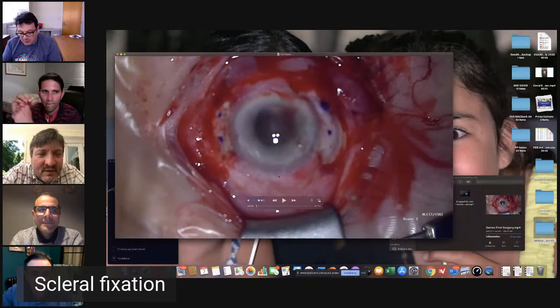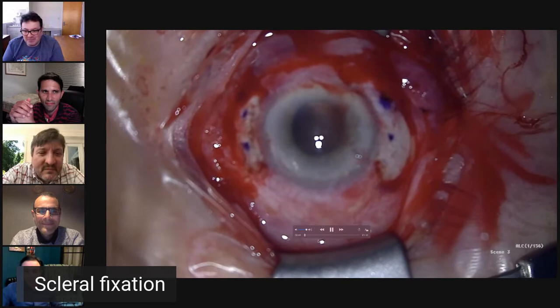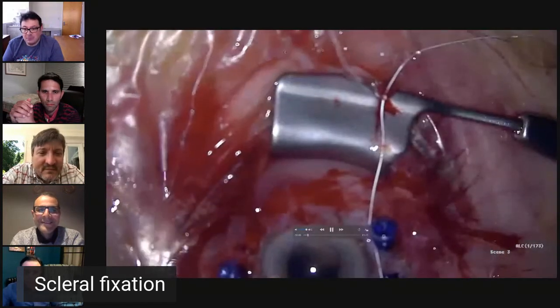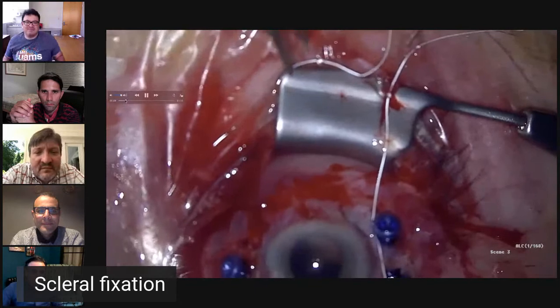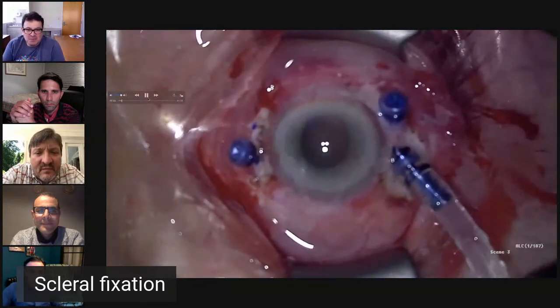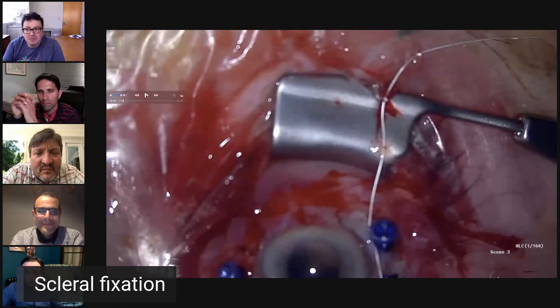So this is my first case. You can see from the start, it's already looking not that great. Yeah, very bloody. So basically I've done the conjunctival incisions. Let me just, one second, where am I? Let me get this out of the way. Now, sorry. So I've done the conjunctival incisions. I've marked my landmarks and my Gore-Tex suture there.